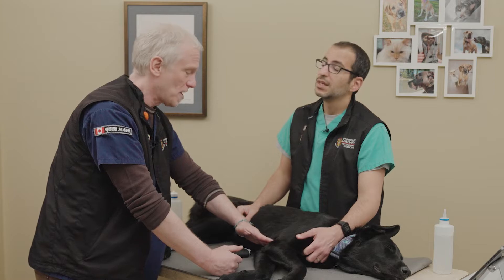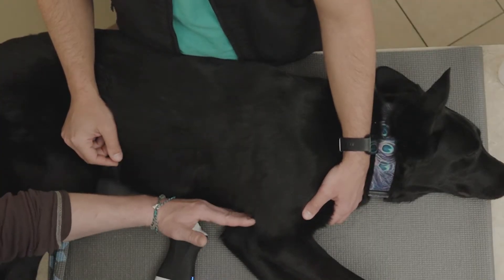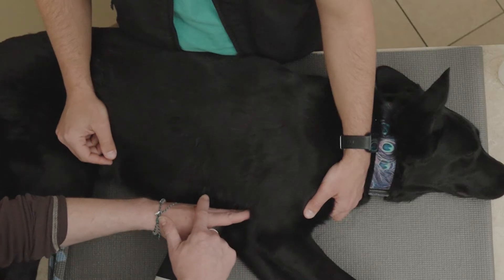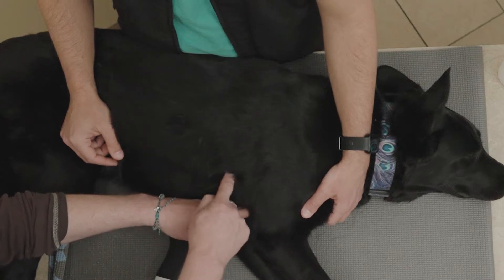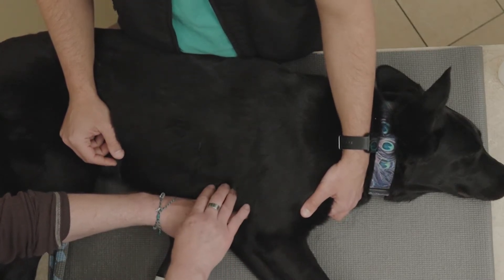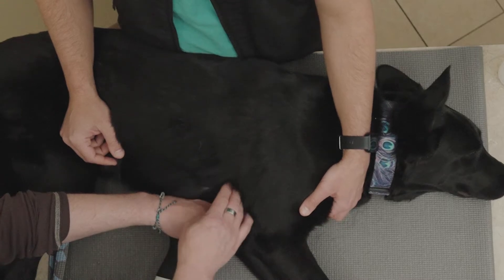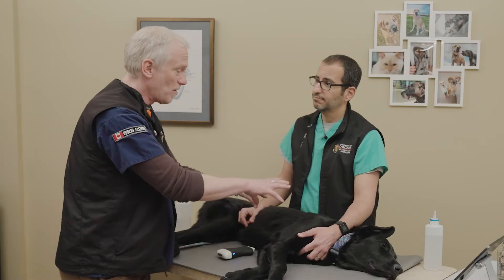Ventrally we have two borders. We have the ventral pleural border — the most ventral we can go before we hit the sternal muscles. However, in many patients, just as we see on x-rays and in cardiology, there's a cardiac notch. When we have that cardiac notch, the lung doesn't come all the way down to the sternal borders — we're actually sitting over the heart itself. So we have a ventral lung border that deviates dorsally at that cardiac notch, and then we have that ventral border where the sternal muscles are.